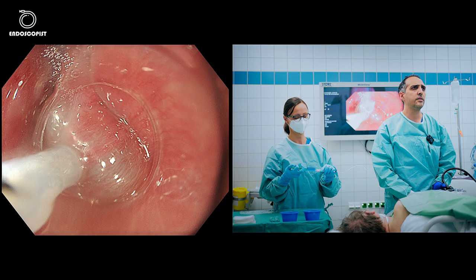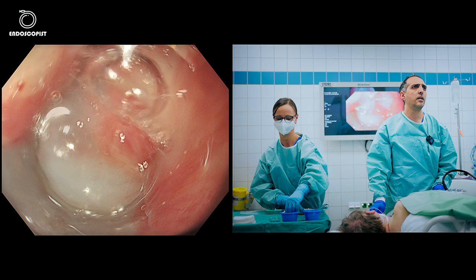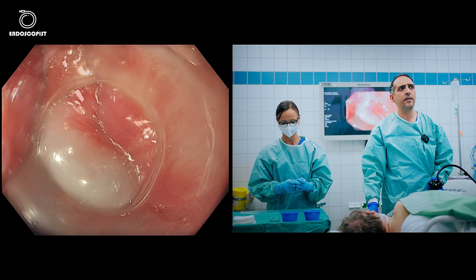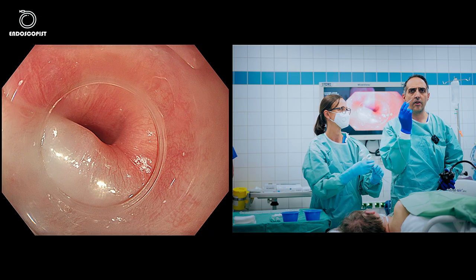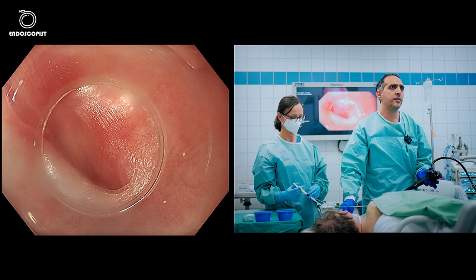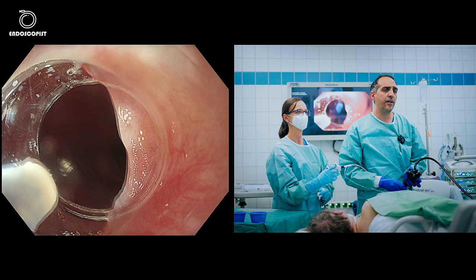We injected approximately three milliliters of normal saline mixed with indigo carmine. I'll now use the knife — this is the triangular TTK knife from Olympus. I'll try to pass the diverticulum again; as you can see, it's quite tight here. This knife has a jet function, meaning you can inject with it directly.